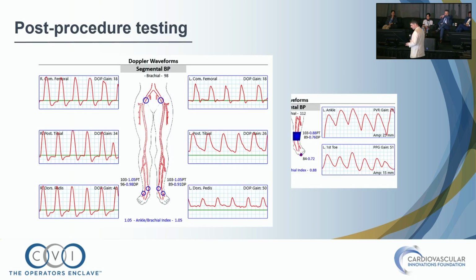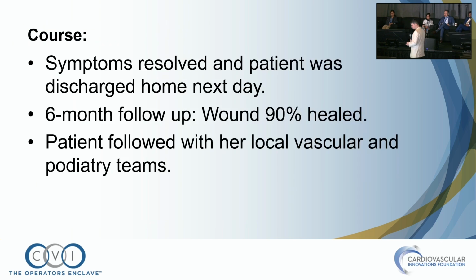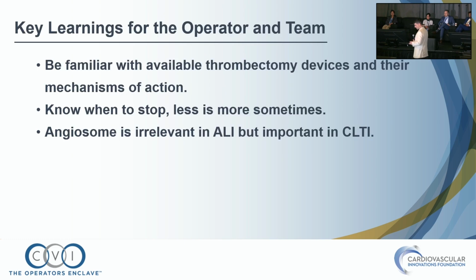And this is her left side ABI and toe pressure after the procedure, second day. She only saw me remotely because she's an hour away, but she followed with her local vascular podiatrist. But at 6 months virtual follow-up, 90% healed her wound, and of course she had no more ALI symptoms.